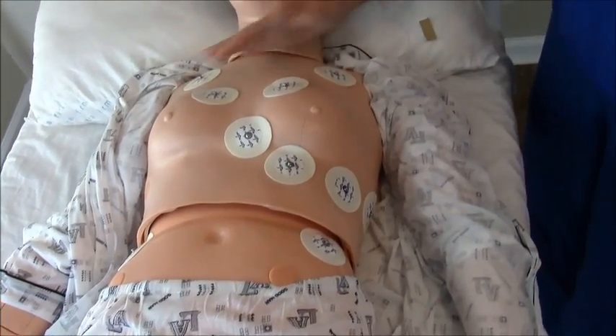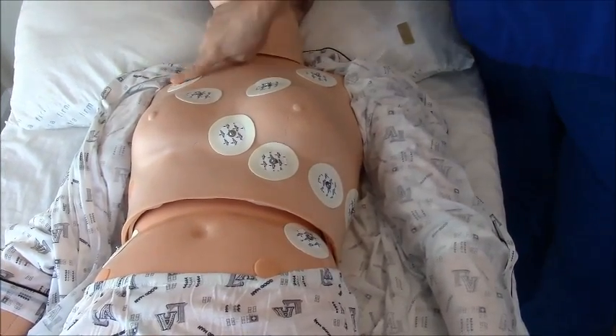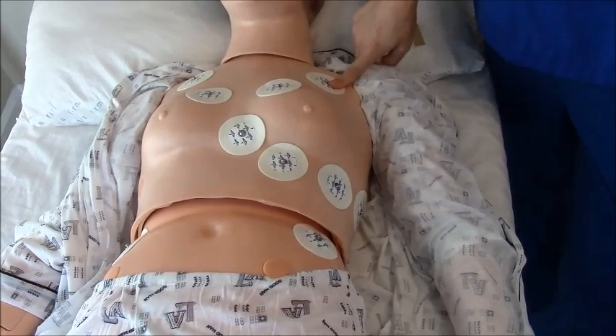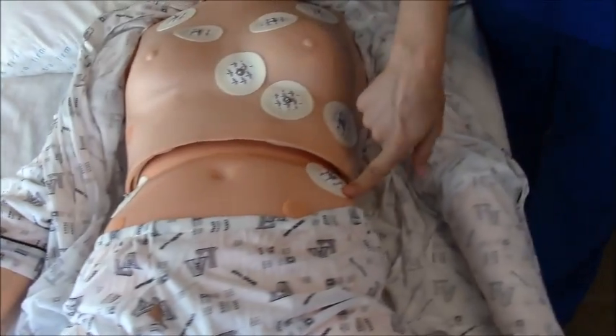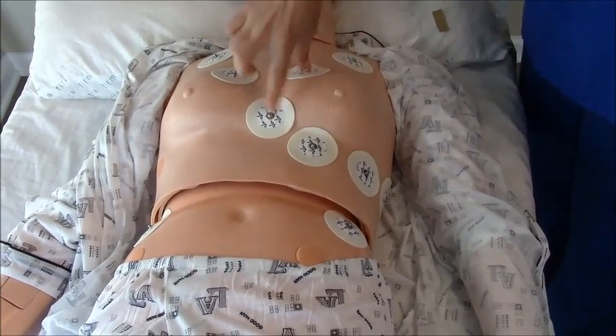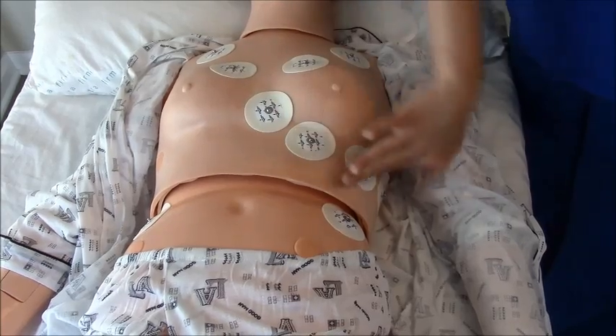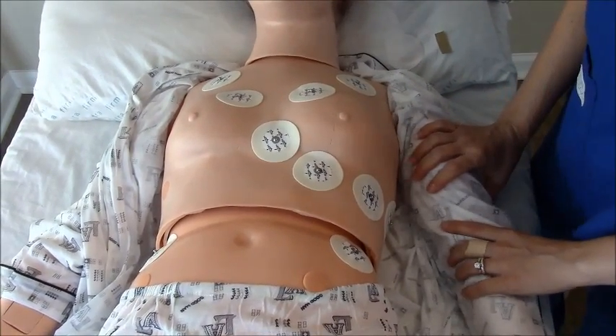There is your 12-lead EKG setup. Let me review them: you have the right arm lead, the left arm lead, the right leg lead, the left leg lead, and precordial leads V1, V2, V3, V4, V5, and V6. Your patient is now ready to be hooked up for an EKG.